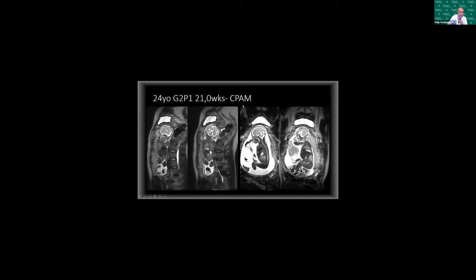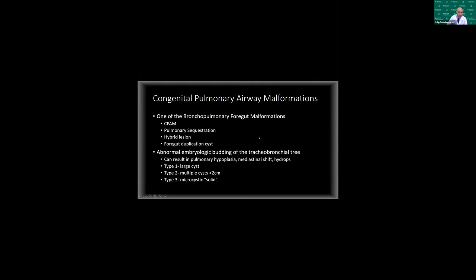The companion diagnosis in our differential for congenital diaphragmatic hernia is congenital pulmonary airway malformation — formerly known as CCAAMs, congenital cystic adenomatoid malformations. In this fetus on coronal views, a normal view through the front of the baby scrolls back to reveal T2 hyperintensity and a cystic lesion. On both sides we can see a complete diaphragm — telling us that whatever this lesion is, it does not originate from the abdomen — which is confirmatory of a congenital pulmonary airway malformation. There is a spectrum of bronchopulmonary foregut malformations with a classification system.